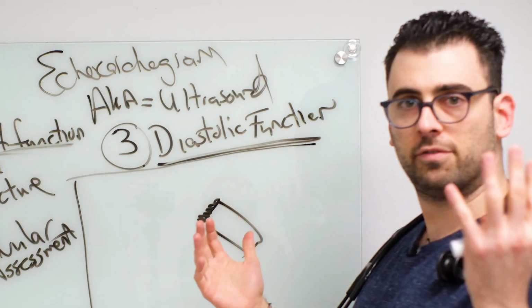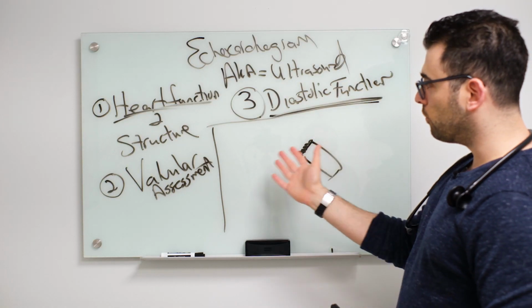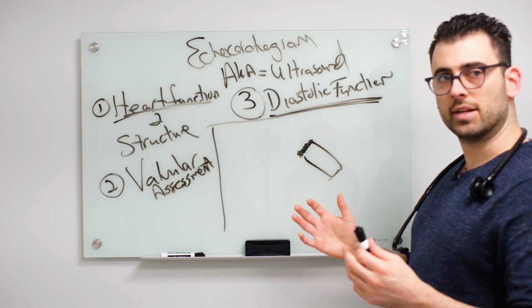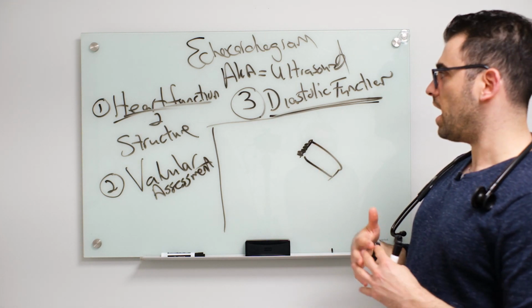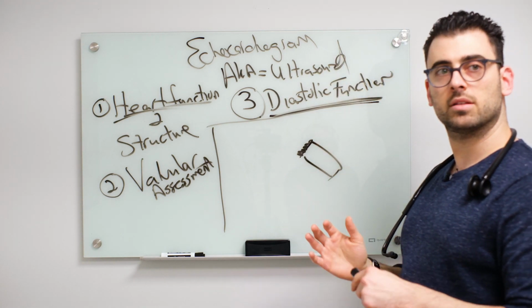You can eat whatever you want before, and you can take all your medicines. It's a non-invasive, safe test, there's no radiation, there's no contrast. So we do it in everybody, pregnant women up to elderly, and no one has any complications from it.